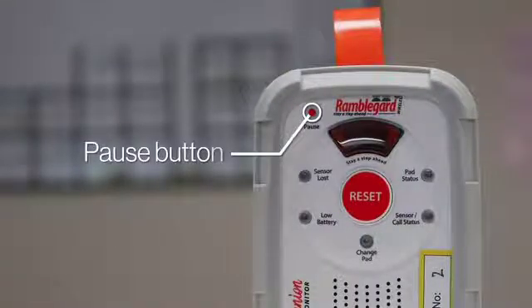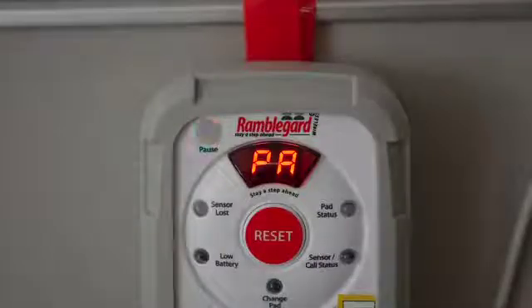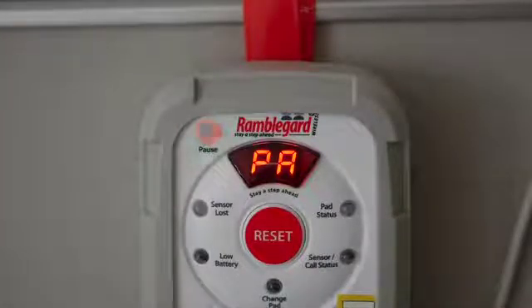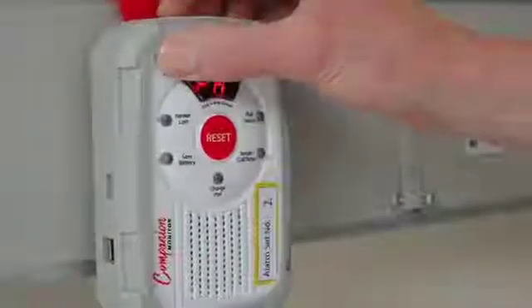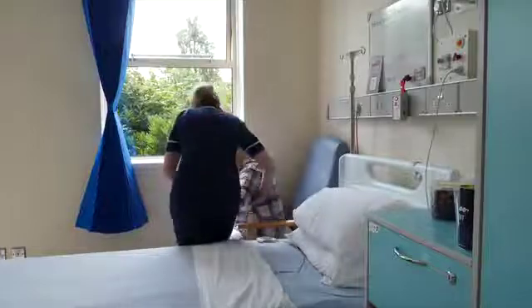The pause button temporarily disables any alarm being triggered on the companion or display panel for a maximum period of three minutes. This allows the caregiver to attend to a patient without triggering an unnecessary alarm.